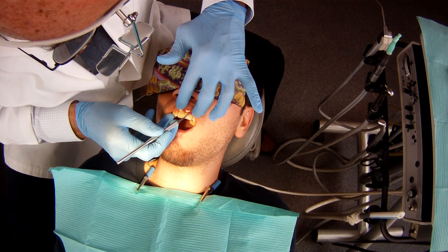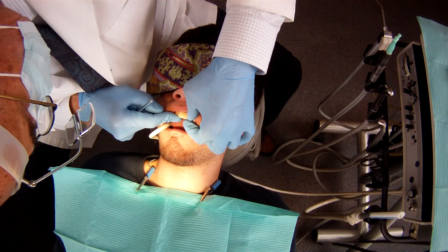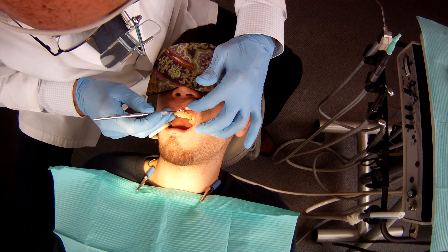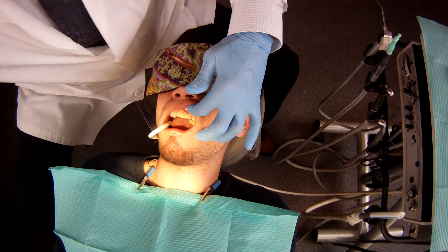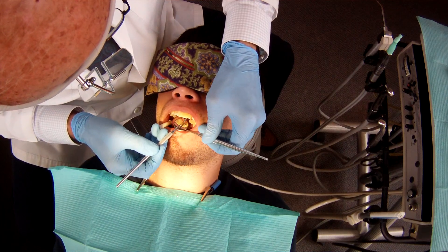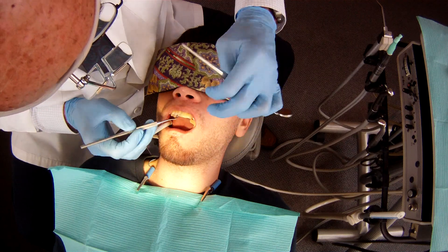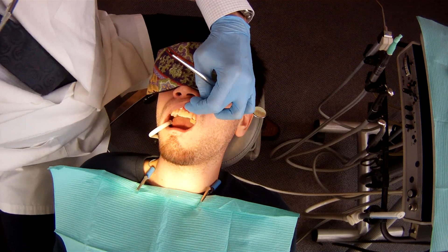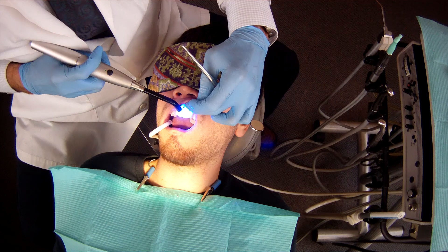Then we smooth the composite. You'll hear me tamping on the tooth a bit — you might feel some pressure here. And then the next phase, I'll be light curing it — bonding it, we call it, or fusing it to the support teeth — so you'll hear some little beeping sounds.